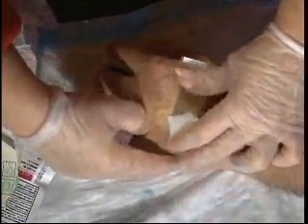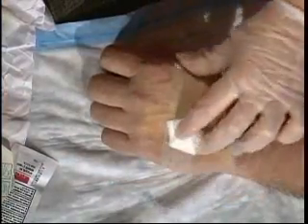Make sure that there is no problem at the skin site of the patient. And for now, I'm just going to secure this gauze with a piece of tape while I continue to clean up my area from pieces and need to dispose of them, of the trash.